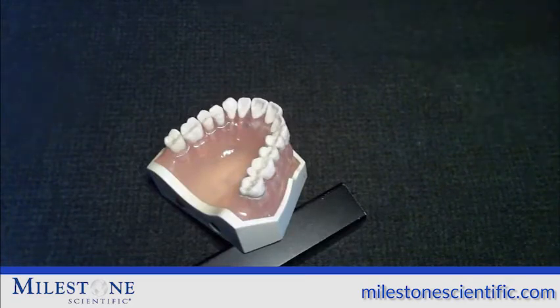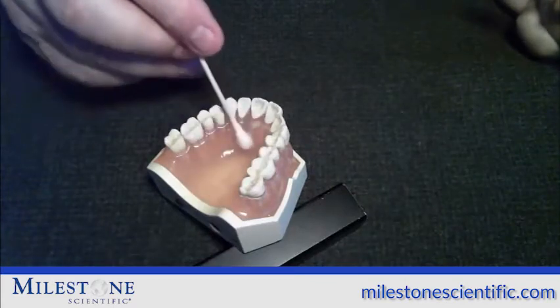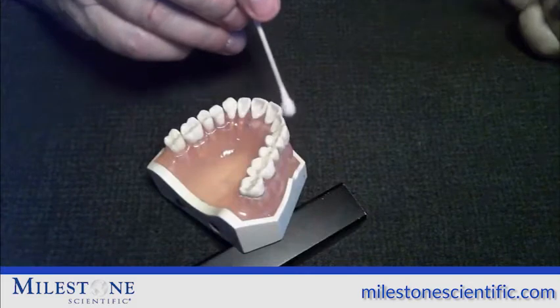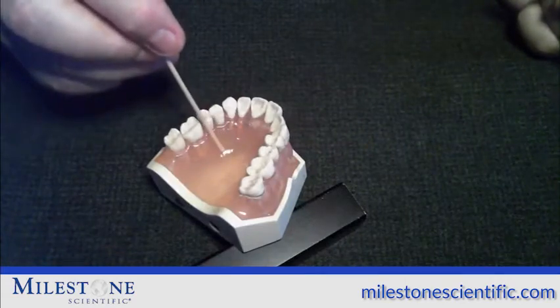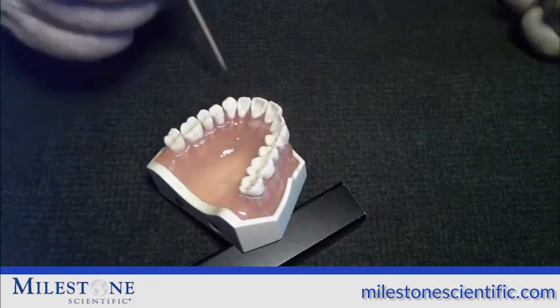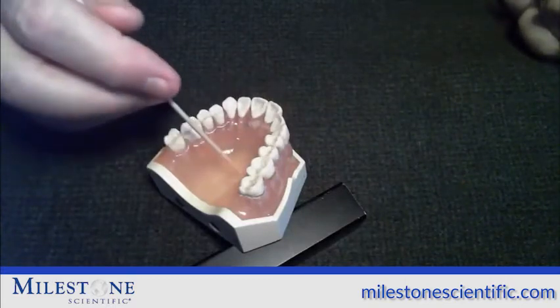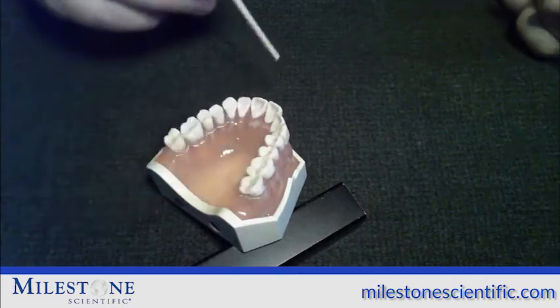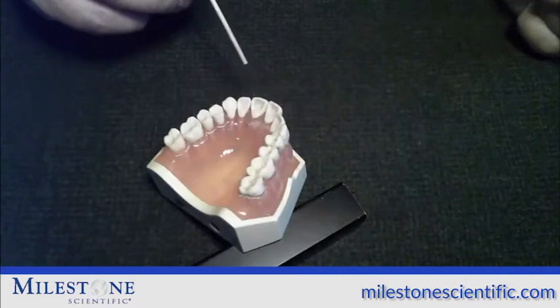You're going to anesthetize from the central incisor all the way through the mesial buccal root of the first molar. All the palatal tissue is completely anesthetized. The buccal and labial tissue is anesthetized from the second premolar all the way through the central on that side of the injection. If you were to use this injection bilaterally, you've anesthetized 10 teeth. What's really interesting about this injection is the patient's lip and face is completely normal — you have not anesthetized their lip and face — but you have buccal, palatal, and labial anesthesia and, of course, pulpal anesthesia. Also, with this injection and a simple PSA injection behind the second molar as an infiltration, with just two injections you've numbed the whole quadrant: both the palatal, labial, and pulpal tissue are anesthetized.